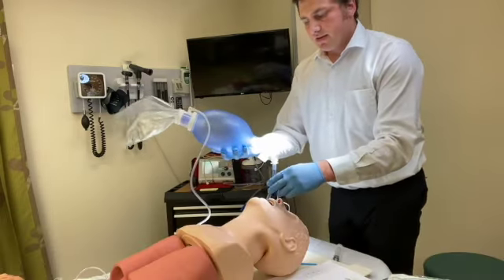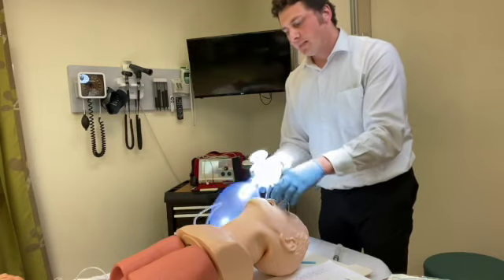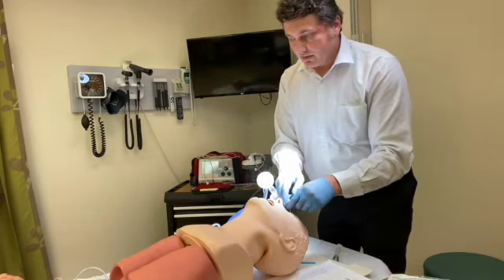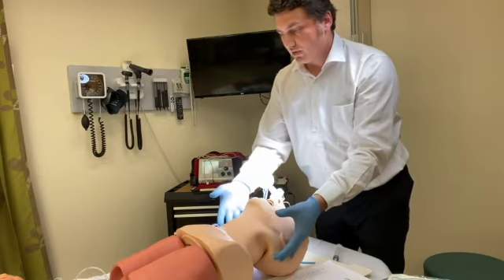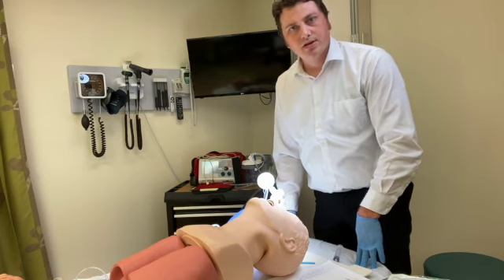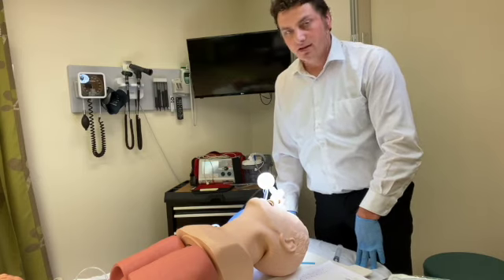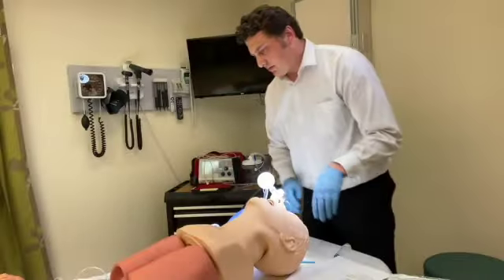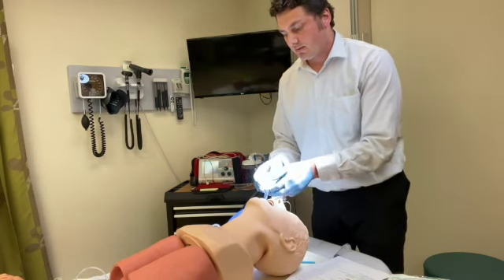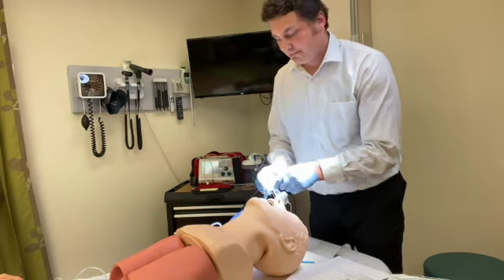Capnometer is in place. You want to tape this down. You can take tape and place it over the nose and drape it around. It is your job to make sure that you do get a chest x-ray to identify that it is in the right location. And then you'll need to maintain analgesia and anesthesia while someone is intubated. Someone should not be intubated while awake.